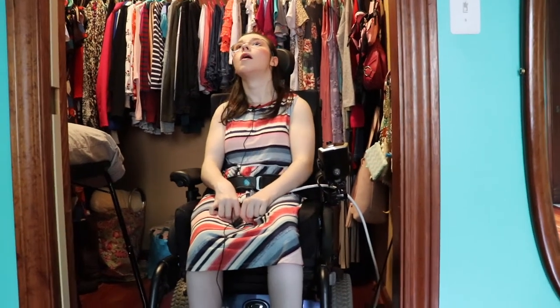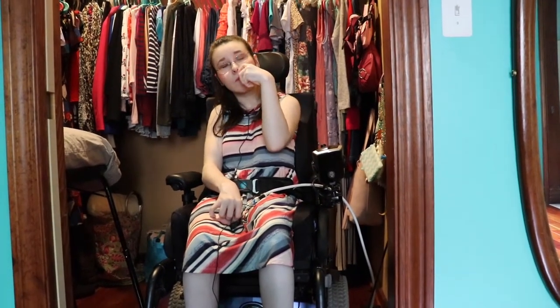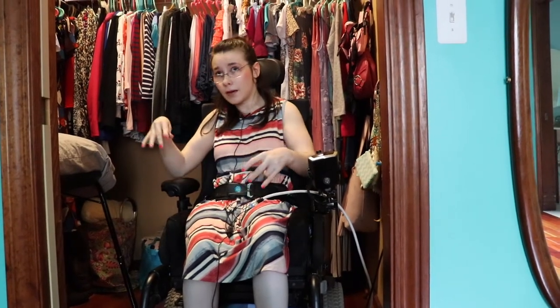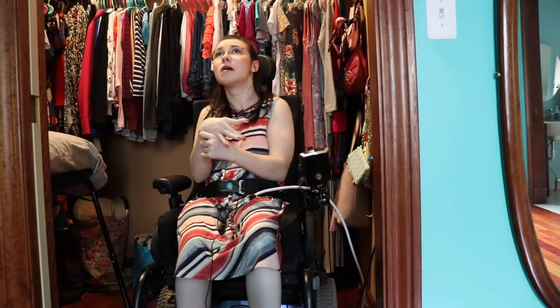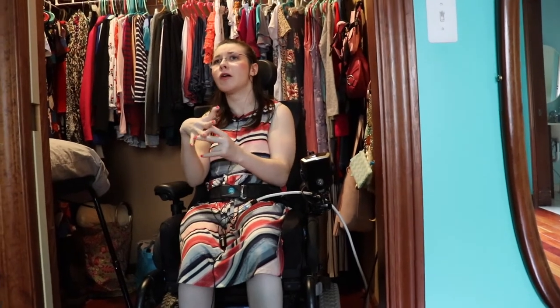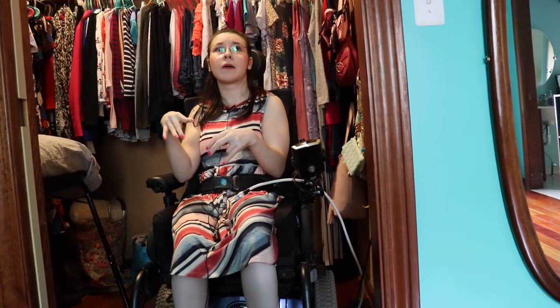In my past residences, we charged it in the foyer area. I would also like to say that every wheelchair is different. In this particular wheelchair that I'm in right now, we have to charge every night to keep the battery going — that's what my wheelchair guy said. But my other wheelchair, I believe, if memory serves me right, it was every other night. So don't quote me on that though.